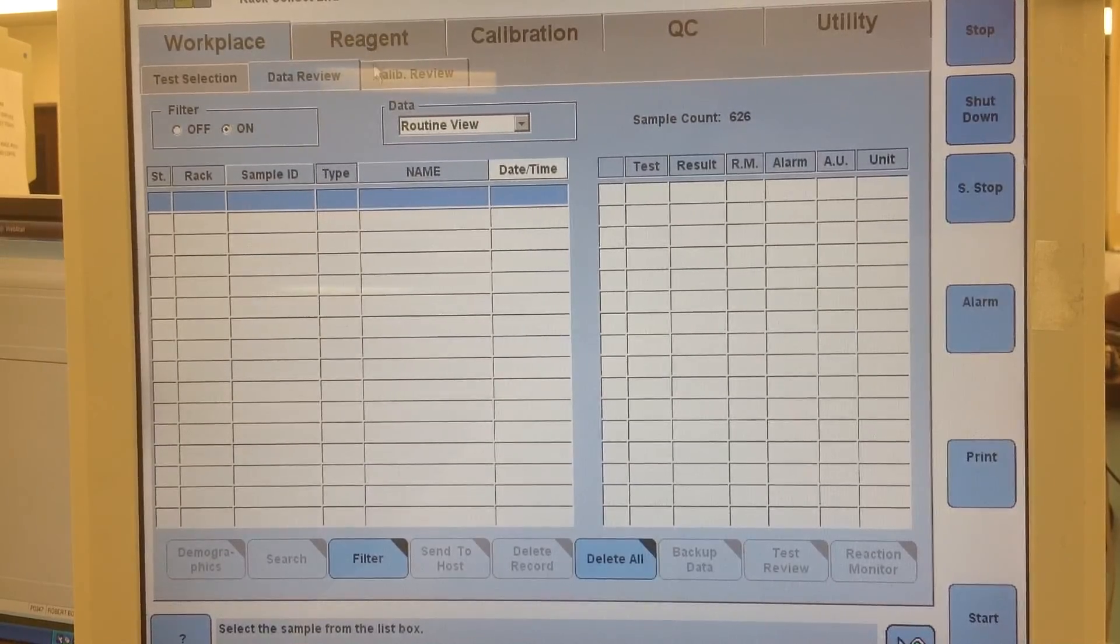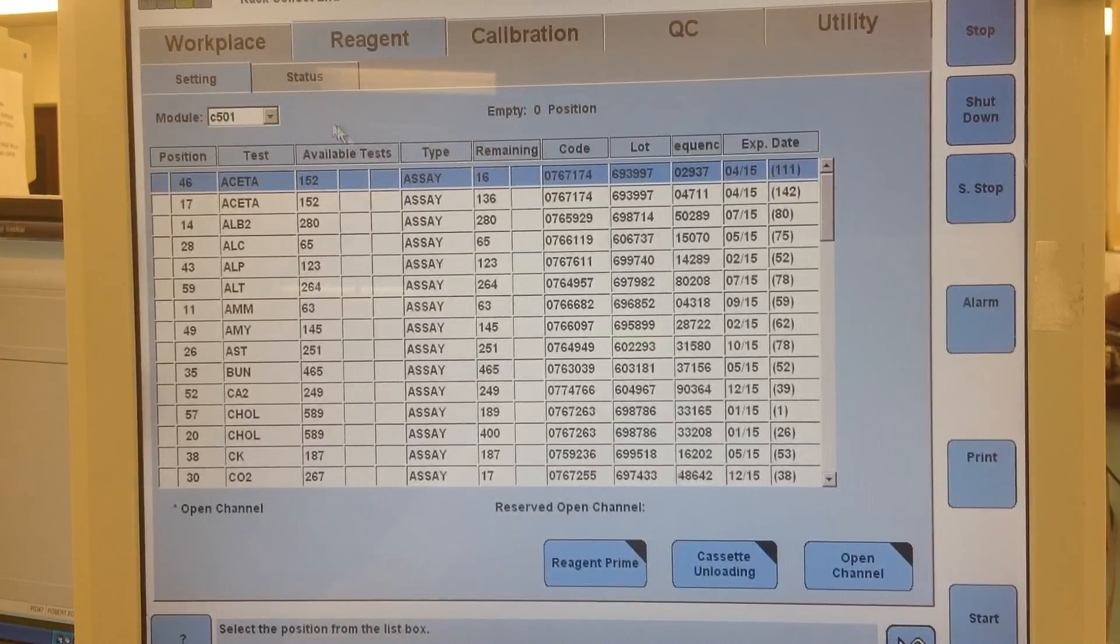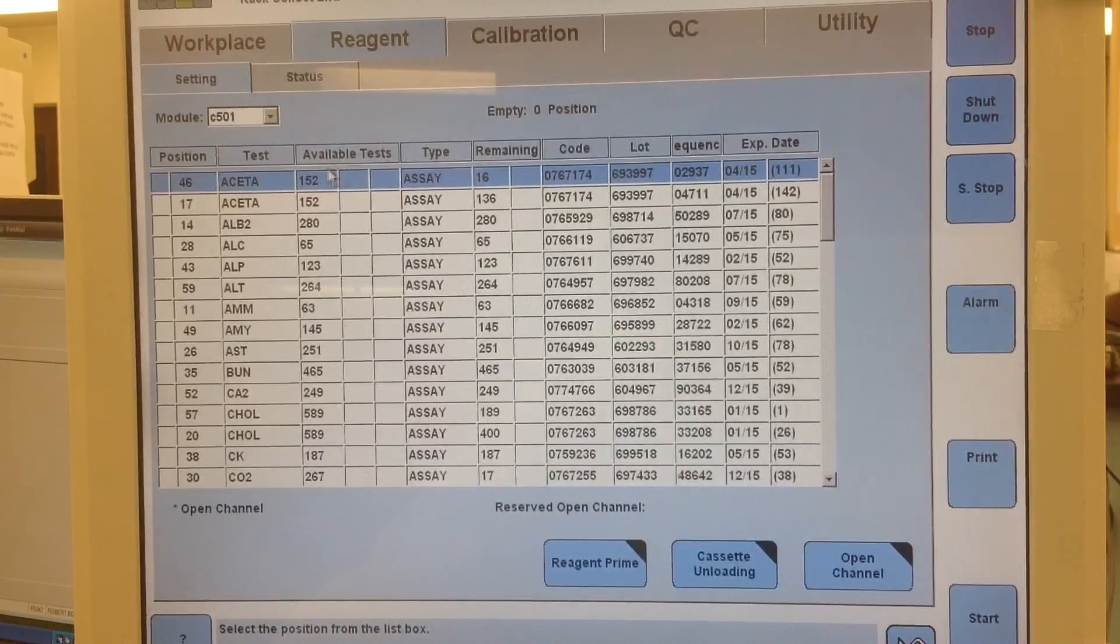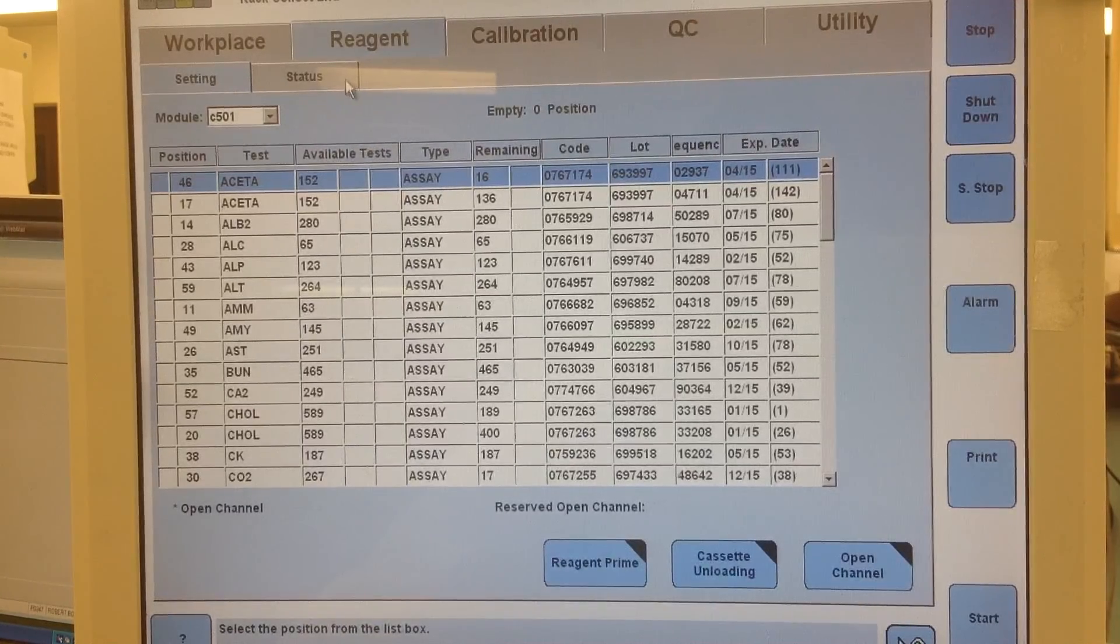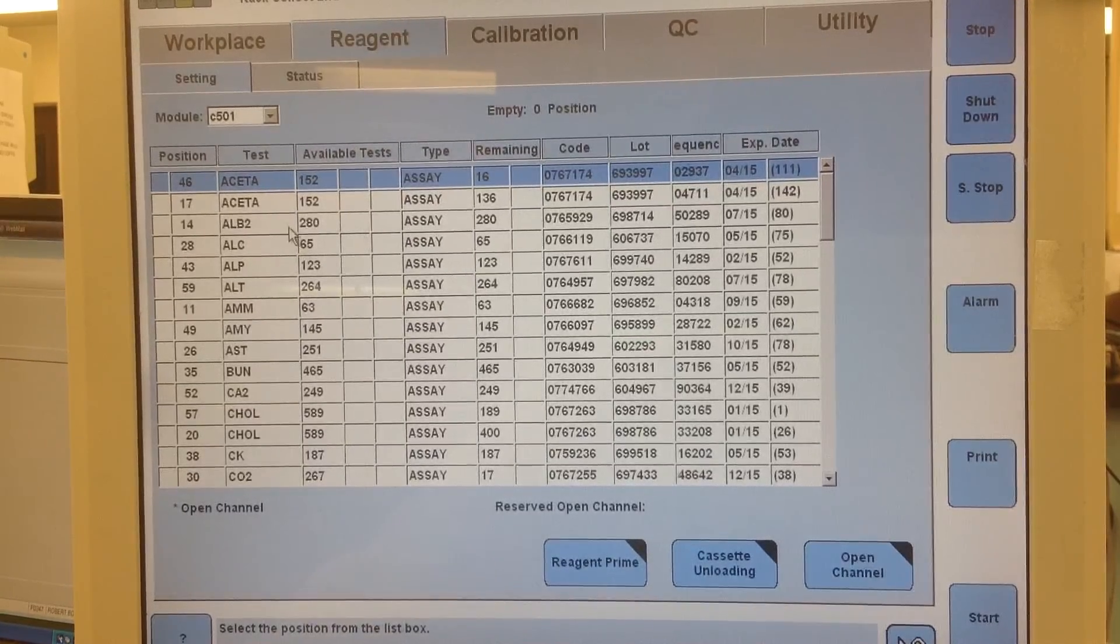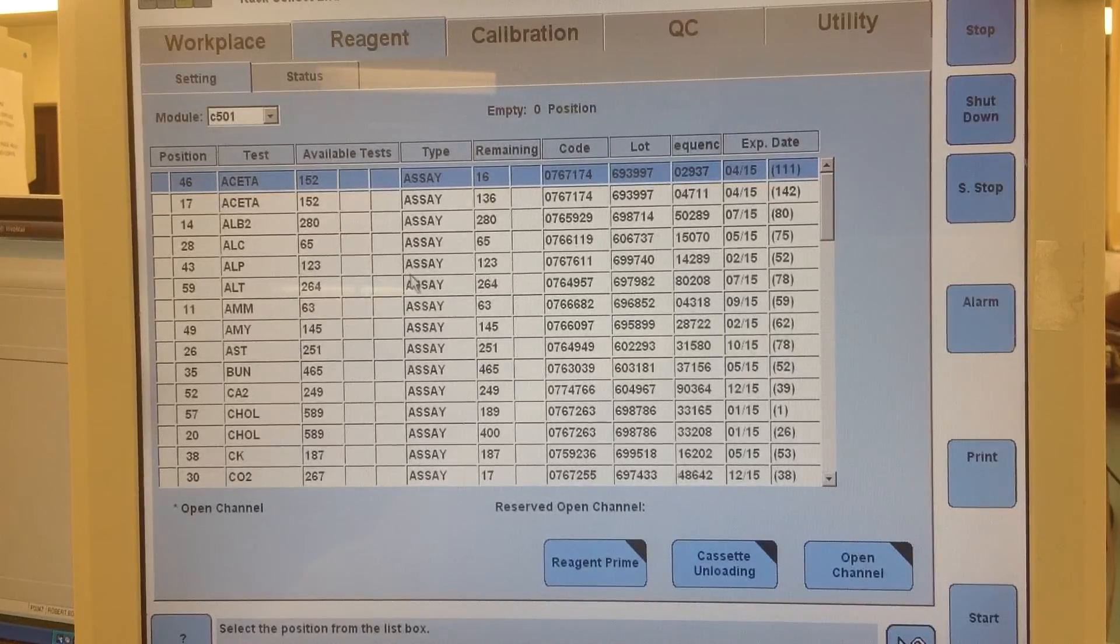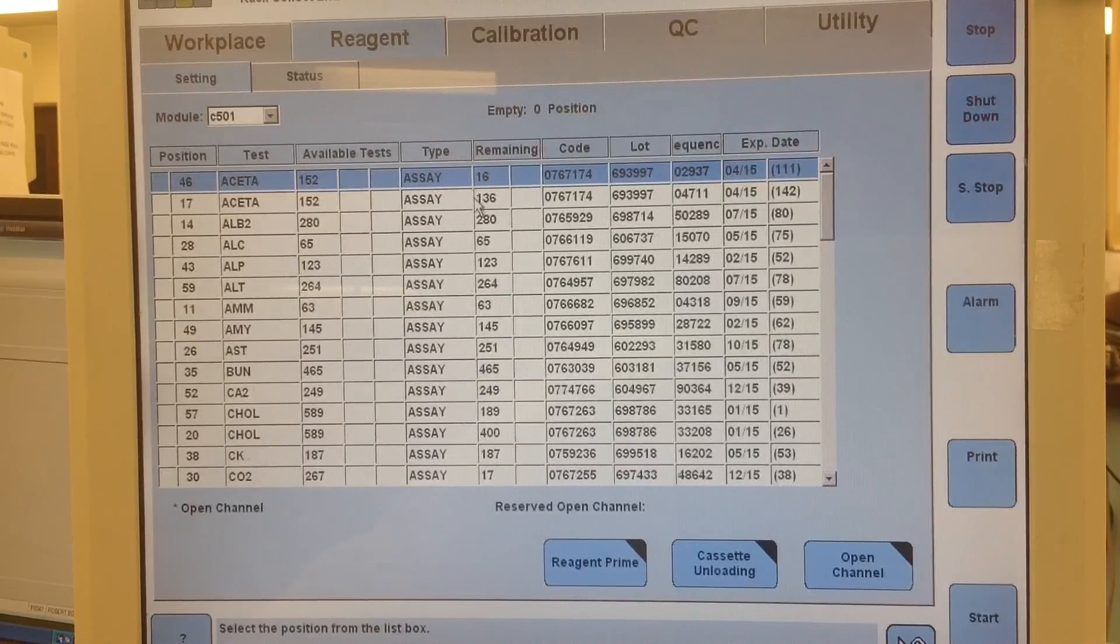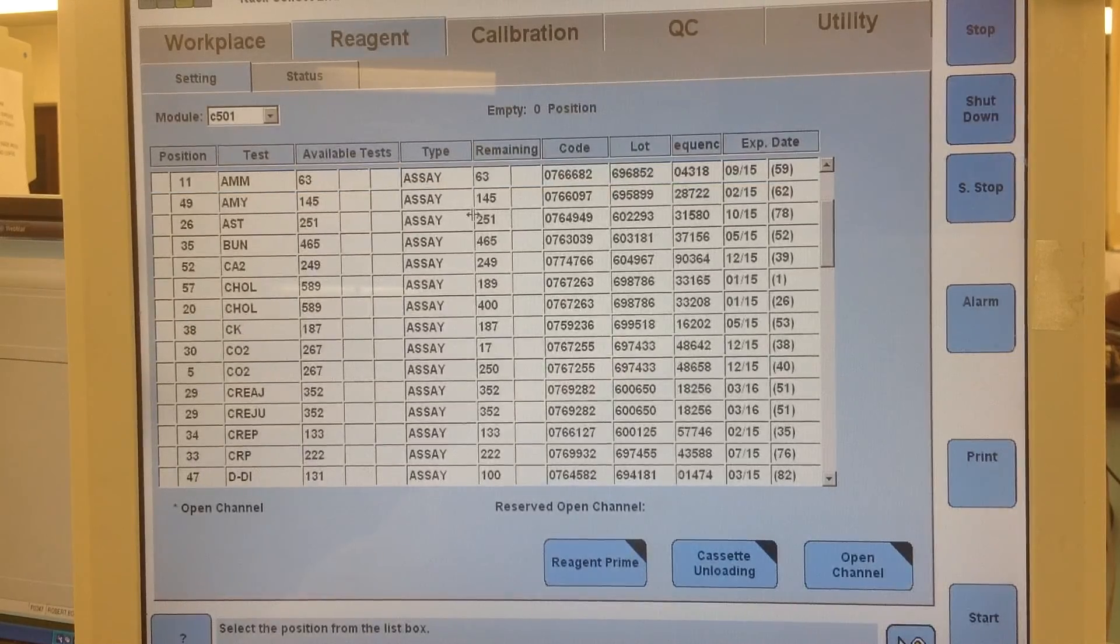So real quickly at the beginning of the day I'll go through and come to Reagent from Workplace, and in the Settings section I'll scroll down and check how many are remaining for each cassette.